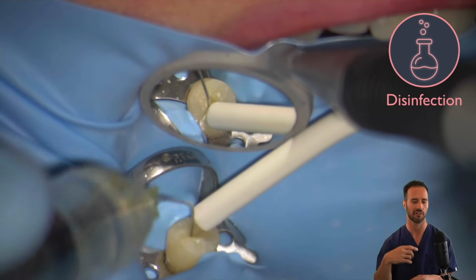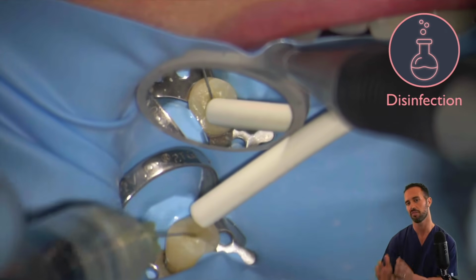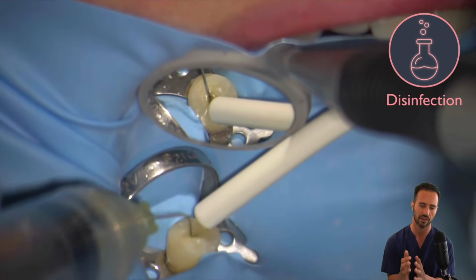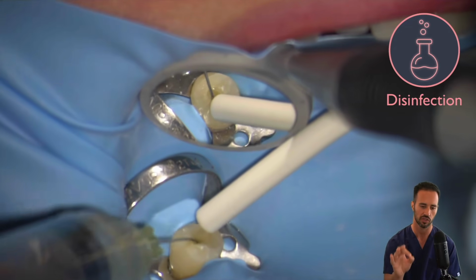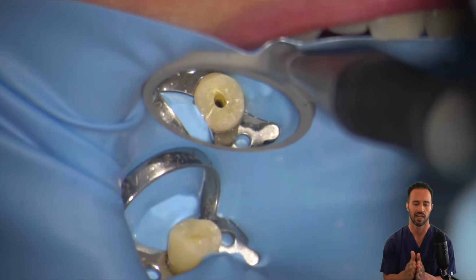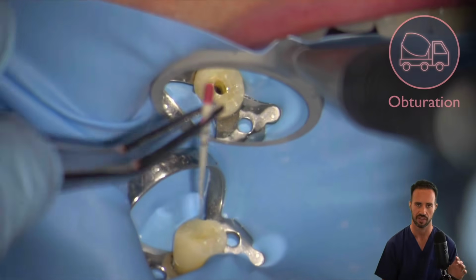All right, so this is our final flush with our sodium hypochlorite that's going to complete the disinfection stage of our treatment. And you can see we have a nice, neat area that we're working with. Okay, the assistant is holding the surgical suction tip right up against there, so there's no leakage at all of the sodium hypochlorite. And now we're going to progress to the obturation phase of the treatment.